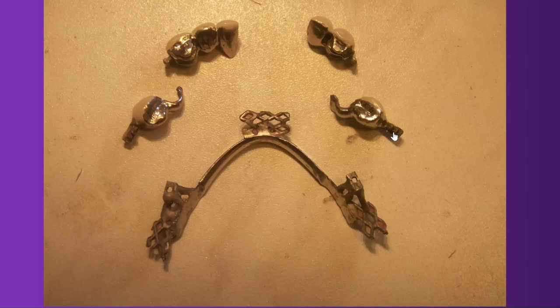That's the tooth that was containing the attachment, the resilient element, the arm that would sit on the shoulder, the interlock there, same on the other half arch. It's a principle that if you do frictional system on one side, you have to do frictional on the other side as well.